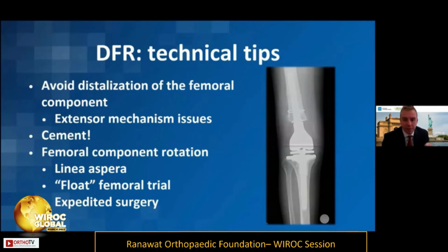What I do is I clamp the extensor mechanism and really look at the patellar height and flex the knee to make sure that the distal femoral component is not coming basically out and pushing on the arthrotomy too much throughout flexion. As you see here, these patients obviously are already shown to have poor bone quality and fracturing. So I think cement fixation is ideal for them.